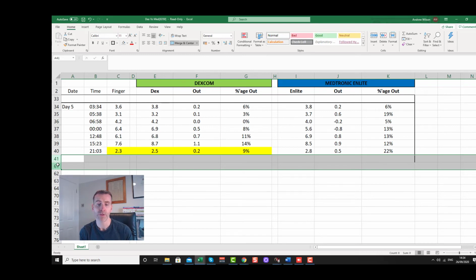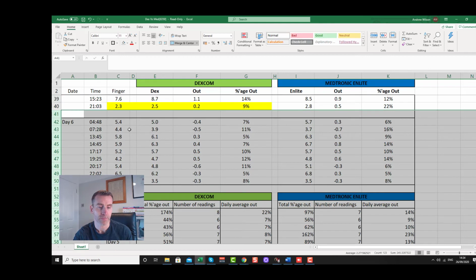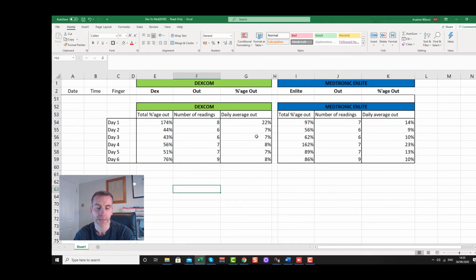For those of you that are really concerned with going low and having low blood glucose, actually that's pretty damn good as well. You want it as accurate as possible in those situations to give you a good gauge of when that's going to happen. There's day 6. Okay, so we are at the end of day 6. What I've done here is given you an overview of the Dexcom and the Medtronic.